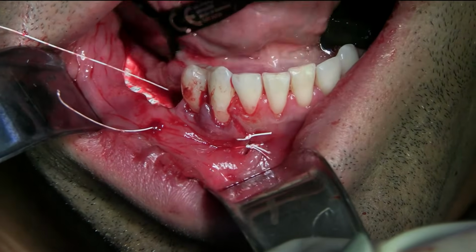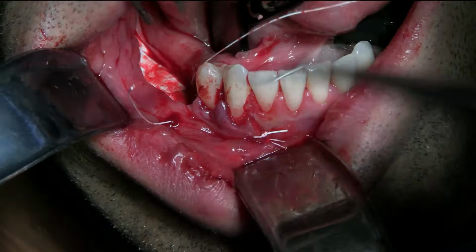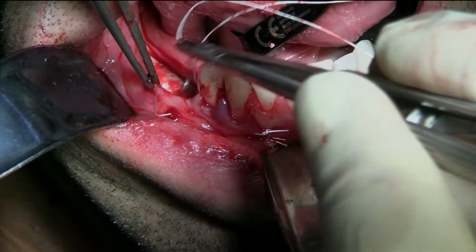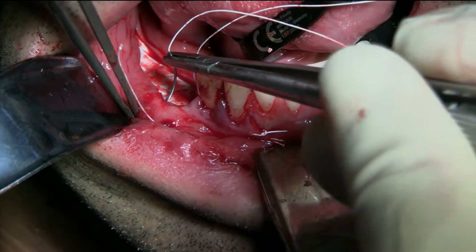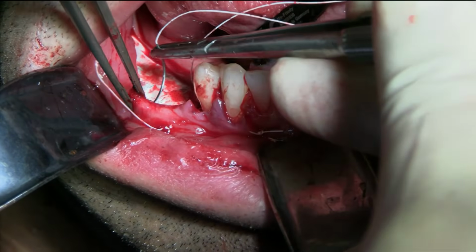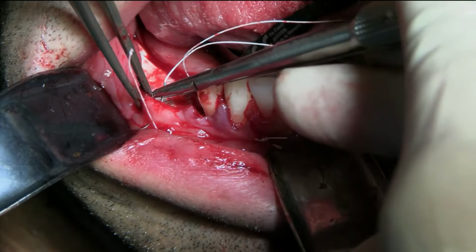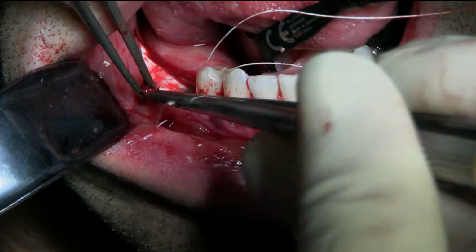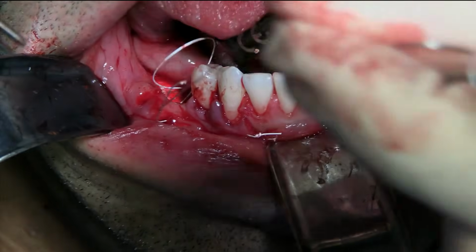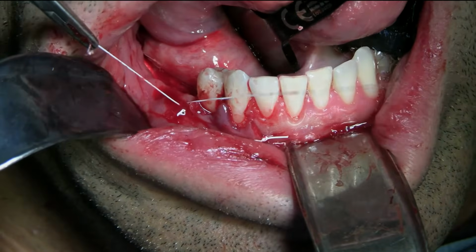And I'm going to exit the buccal. Okay. Now let's see what's going to happen. My mattress is done. And here's my closure.